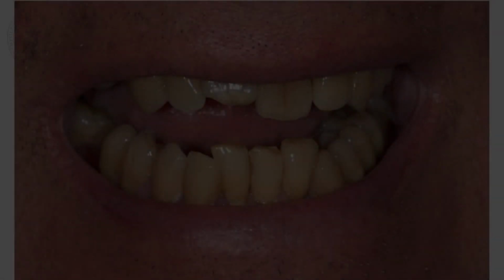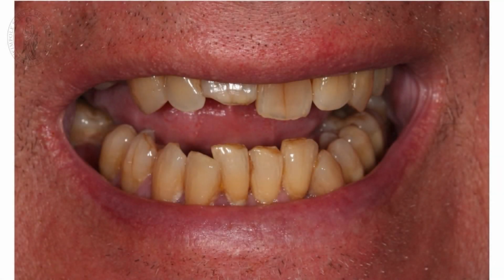Of course, we have cases as well where we don't have just white teeth. And you can see here how far we have come. This is a bridge case from 2019. The patient didn't brush his teeth very well, didn't care for color very much, not very beautiful teeth, but of course we have to manage somehow to have our work fit into the situation perfectly, which in this case, as you can see, is quite colorful, very difficult.